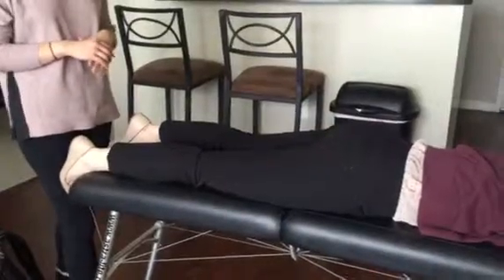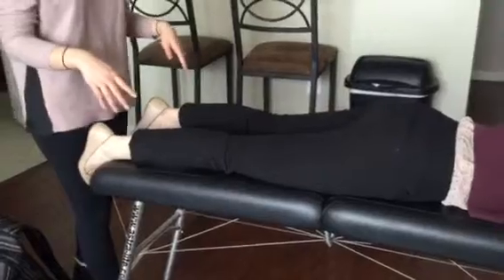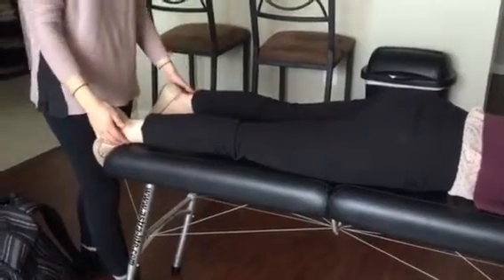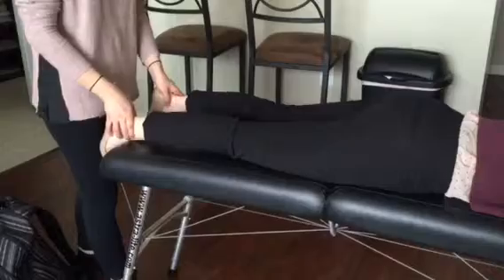Okay, so we're doing the TRT lab final, and we're going to start by having proper patient positioning, making sure she's centered on the table from her coccyx to EOP, and then making sure the tops of her shoes, or the tops of her feet, are at the edge of the table.